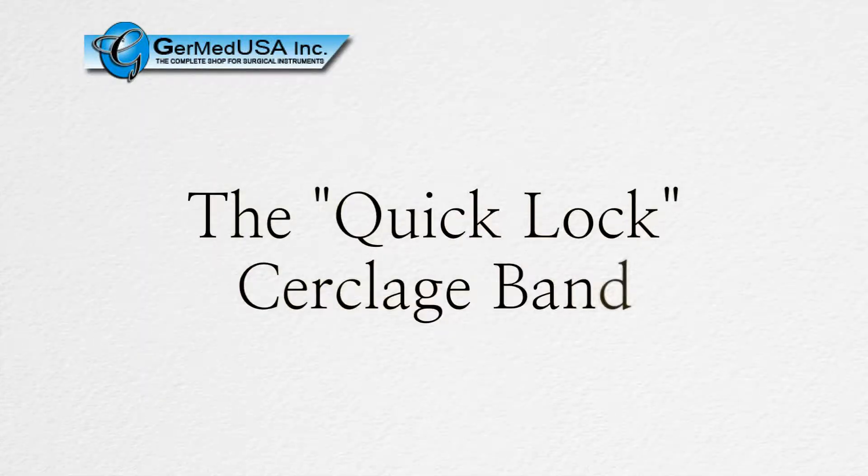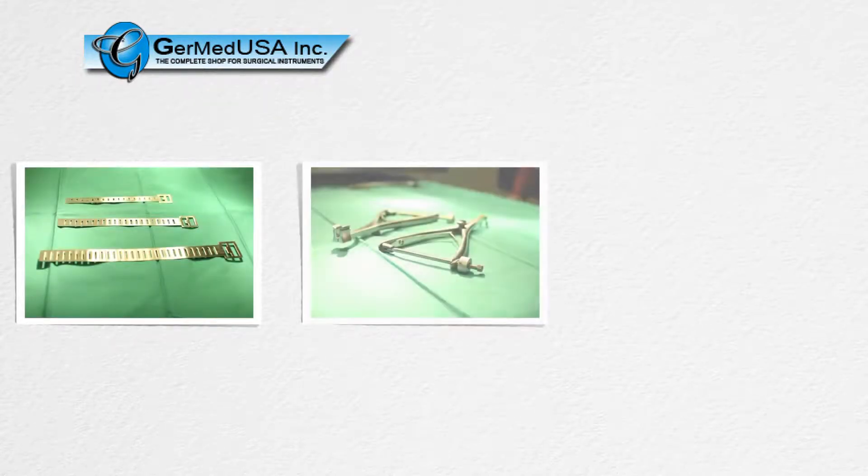This is the introduction to the QuickLock Circlage Band System. This is designed to take the place of traditional circlage wire. This system is comprised of three different pieces of equipment: the circlage band, the tensioning device, and the passing guide.